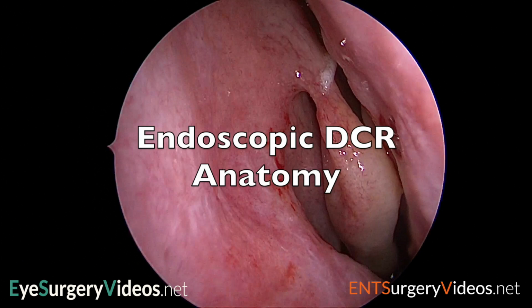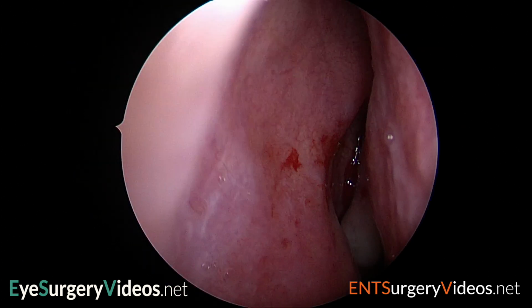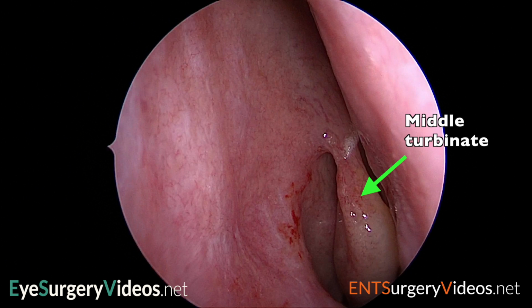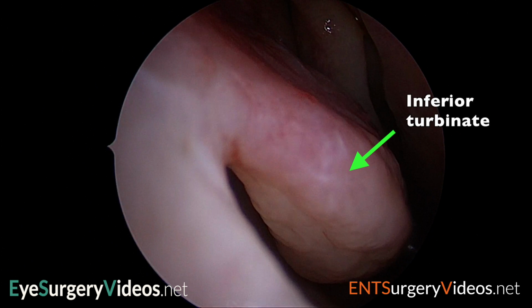A good understanding of the internal surface anatomy of the lateral wall of the nose is fundamental for both endoscopic and external DCR surgery. This understanding will enable the creation of an adequately sized and appropriately positioned bony ostium, and then complete marsupialization of the lacrimal sac, and will also help avert damage to neighboring structures such as the orbit, skull base, and sinuses.